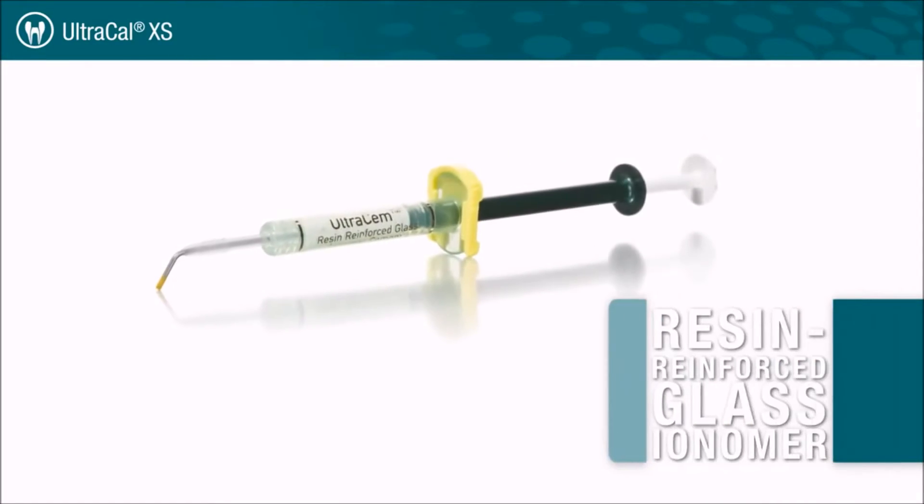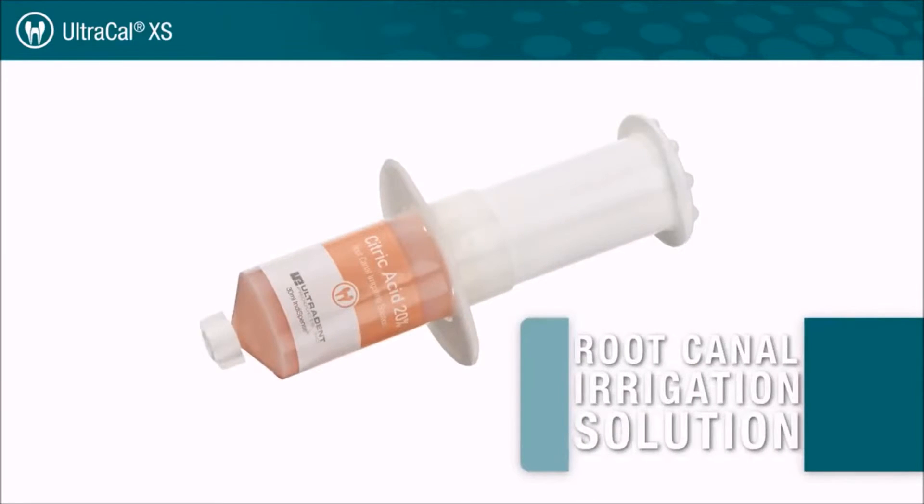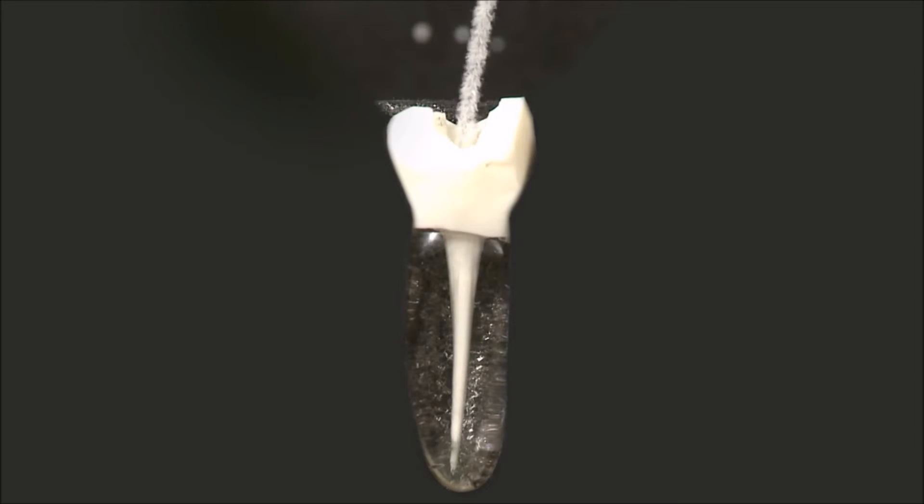If the use of a glass ionomer is preferred, Ultradent's Ultrasem resin-reinforced glass ionomer is an excellent choice. The removal of UltraCalXS is thorough and easy using Ultradent citric acid delivered with the NaviTip FX tip.